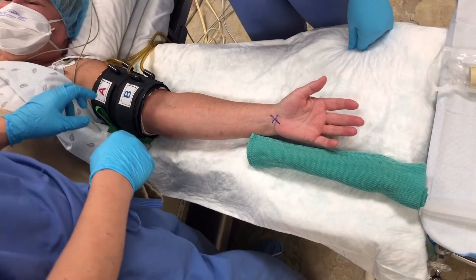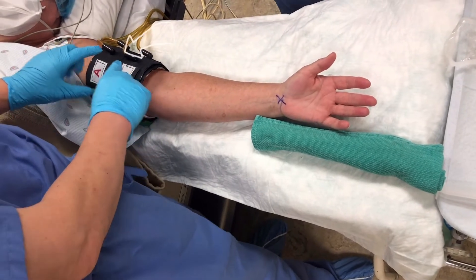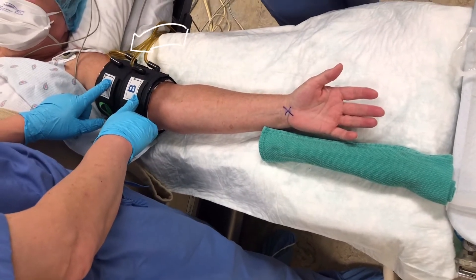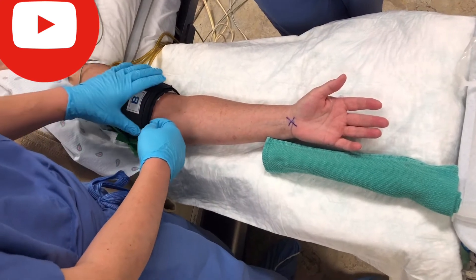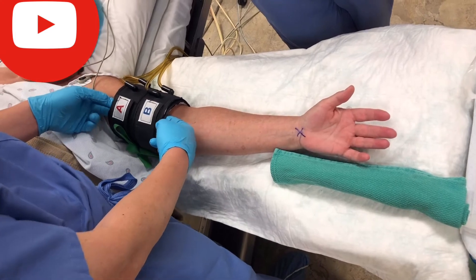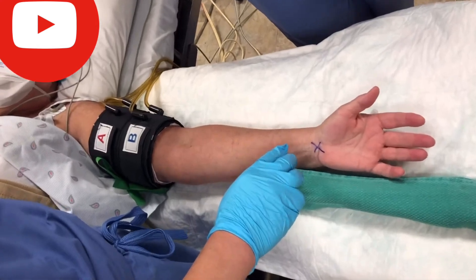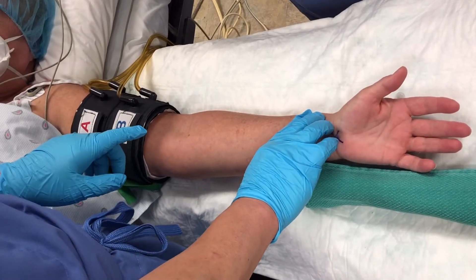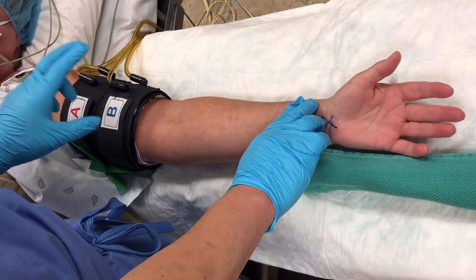All right, this is the Bier block regional technique. It's very important to put on a double tourniquet — you want to make sure it's pretty tight. You can put only two fingers inside to check. Another way to confirm it's good is to inflate the tourniquet and feel the pulse. If the radial pulse disappears, that means it's good.